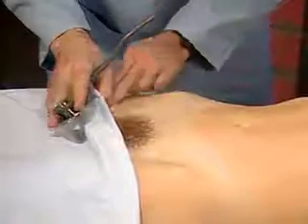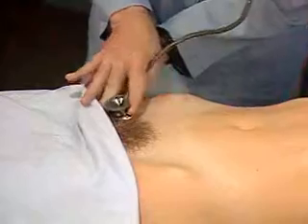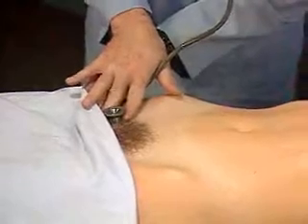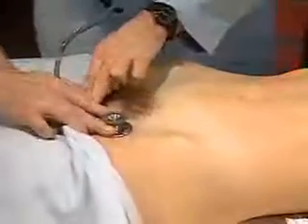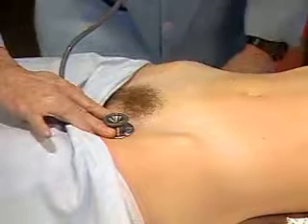Then identify and listen over the right femoral artery and left femoral artery.